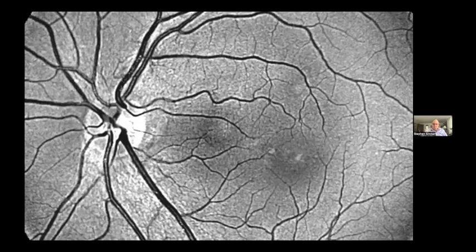So, Dr. Sinclair, we have a picture here that's showing multiple microaneurysms at the level of the capillaries in the retina. Why is it so important to pick these up? And what do we tell the patient that has these? Okay, these are very important, more important than we've realized in the past. Before, when a doc would look at a fundus and say, oh, you have some microaneurysms, come back and see me in 6 months with diabetes.